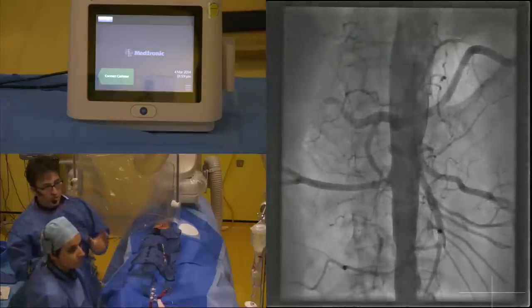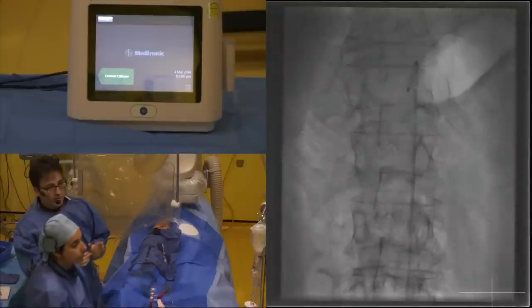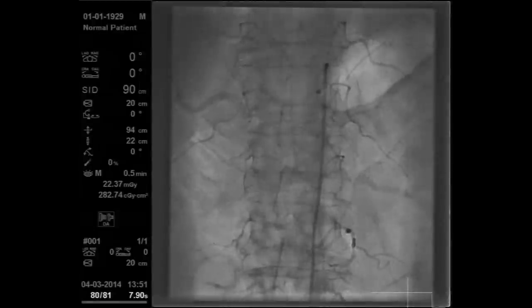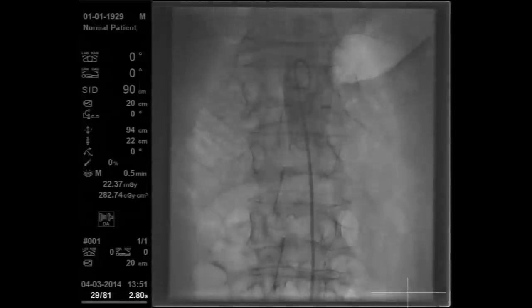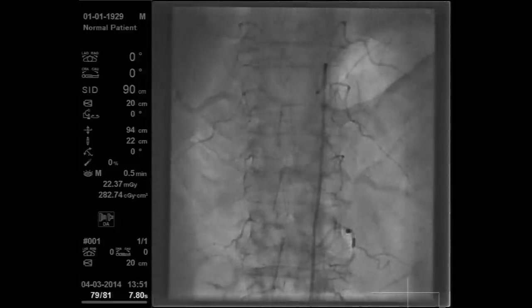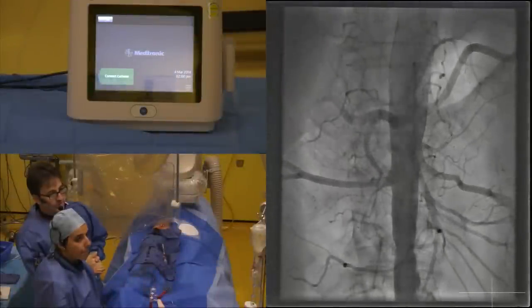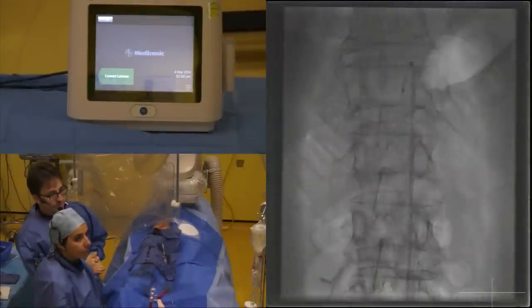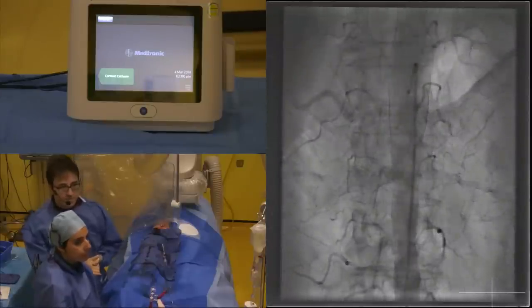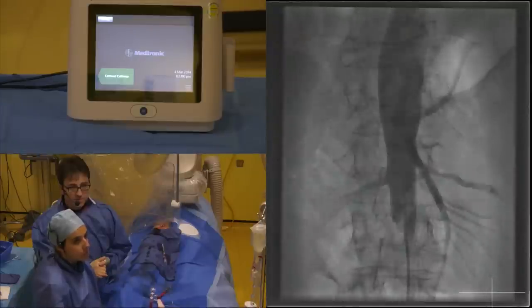This is a non-magnified aortogram, so when we intubate the vessels and put these on mag, they will look bigger themselves. Are you there on your own, Colin, or have you got Andrew or the rest of the team there? Yeah, absolutely. We are all here and I think one point, if you have not done a CT, look very carefully because sometimes you may miss some polar arteries that are big enough to deserve denervation.